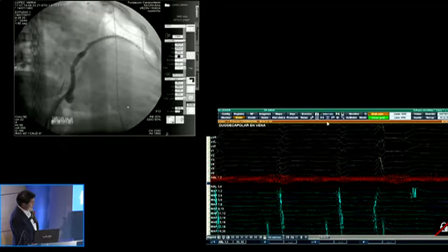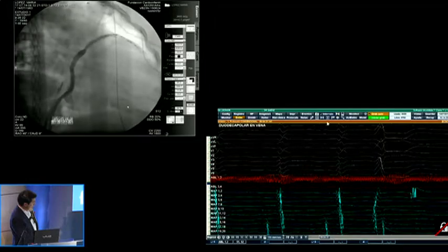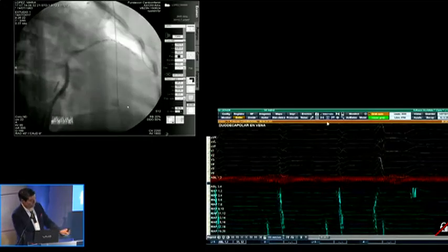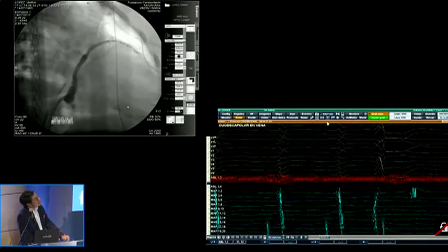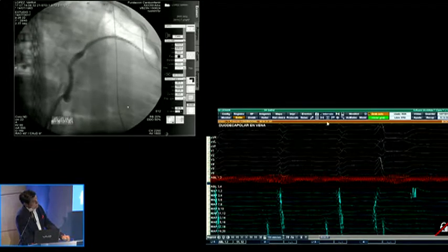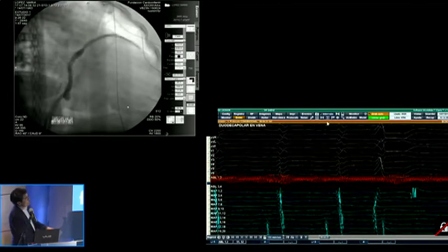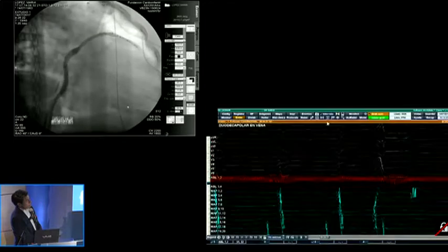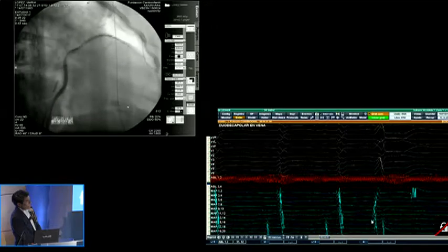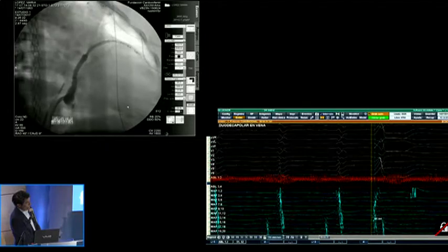Here. Well, this is the first thing we did, and this is important about this technique. First, the electrogram is somewhat different from the extrasystole that Carlos showed us. Probably this is only due to the position of the leads or the electrodes, but what's important is to show, before anything else, which is the most appropriate approach for this case, based on the activation of a catheter. So place the marker at the beginning of the QRS to the earliest phase, which is 13-14. 13-14 is the earliest. It is bracketed in 13-14 and at the beginning of the ECG.